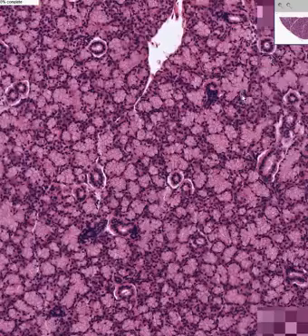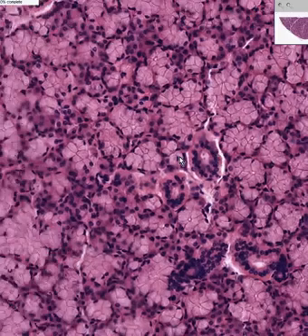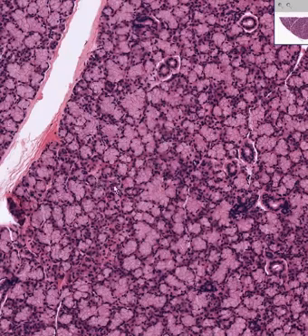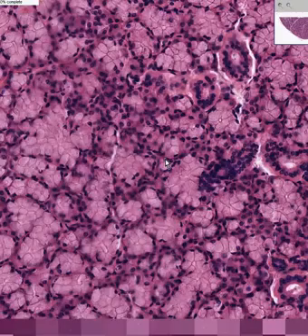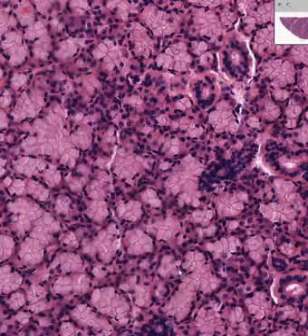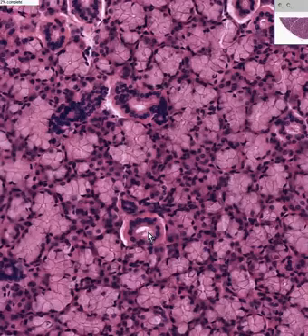But I think I could see here also a couple of ducts. Oh, and I hope I could find them this time. A couple of ducts which look like they really don't have much cytoplasm at all, like perhaps here. And I think this could very easily qualify as an intercalated duct, and maybe down here too. It doesn't look like it has much cytoplasm at all, but clearly, once again, the majority of these ducts, which have abundant red cytoplasm, are striated ducts.